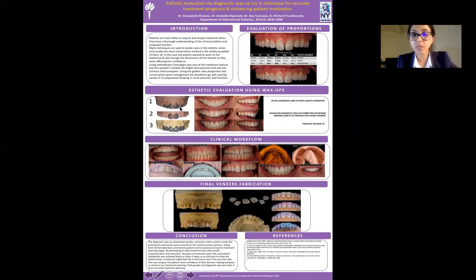As you can see, the first wax-up was an ideal proportion from canine to canine, which we tried in. The second was only for the two central incisors, where we rotated her teeth in the wax-up and used a magic marker to reduce the length. The magic marker is a very good tool that can be used to mask not only length but many different proportions in the mouth. This gives the patient a very good insight into how an Invisalign treatment may turn out.